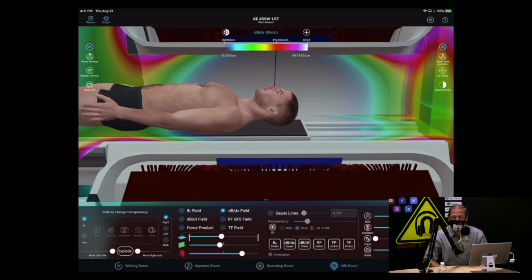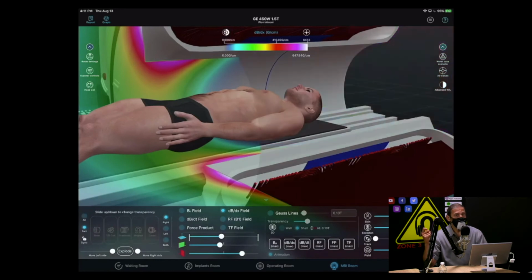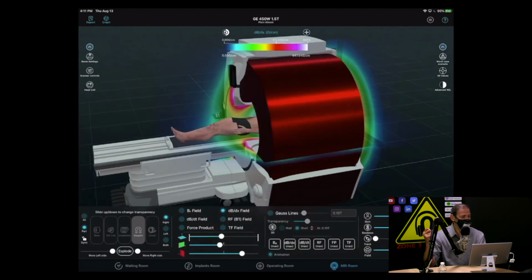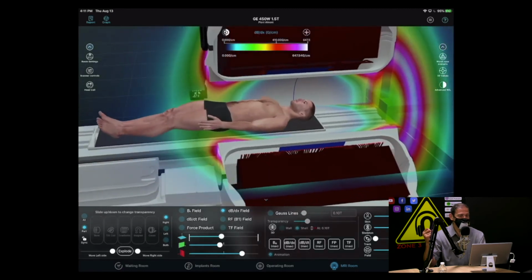You're 1 for 1. It was perfect. So in other words, translation in the center is essentially 0. But look where it's greatest, at the edge of the magnet. Yeah. At the edge. Remember that magnet that we had before? Let's turn the magnet back on. Remember the magnet? So at the edge of the magnet is where that field is greatest.